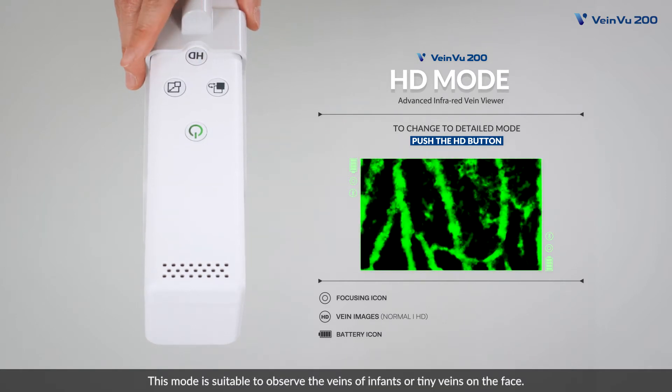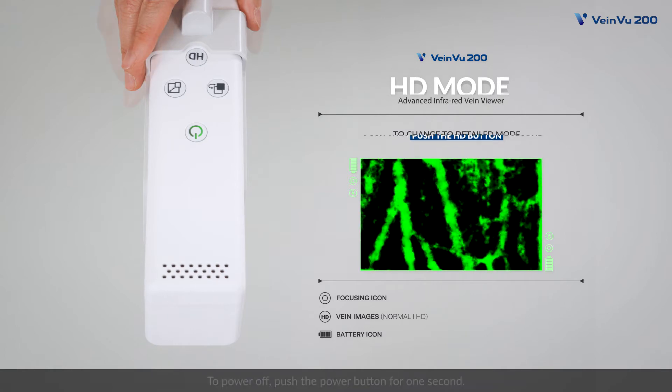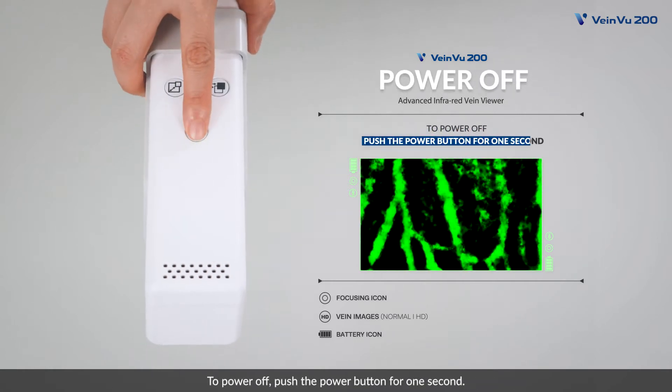The HD mode is suitable to observe the veins of infants or tiny veins on the face. To power off, push the power button for one second.